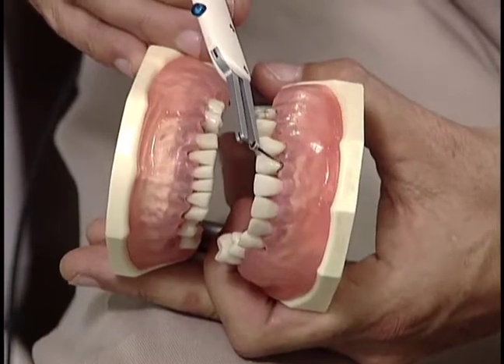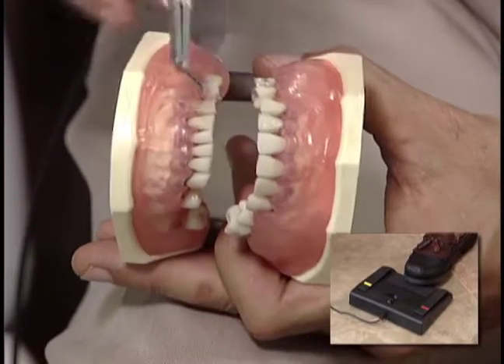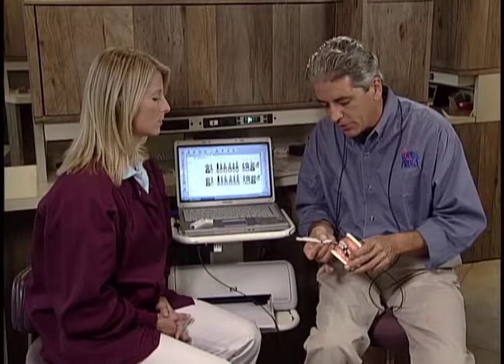What generally happens for a new user especially is they've simply gotten too fast on the foot pedal. I can walk that sulcus with the probe as long as I want. It's not until I come into contact with the margin and step that the computer takes the measurement. So if you are still traveling with the sleeve and you are not in contact with the free gingival margin yet, danger, 9. It usually happens from just getting too fast on the foot pedal, stepping too soon.